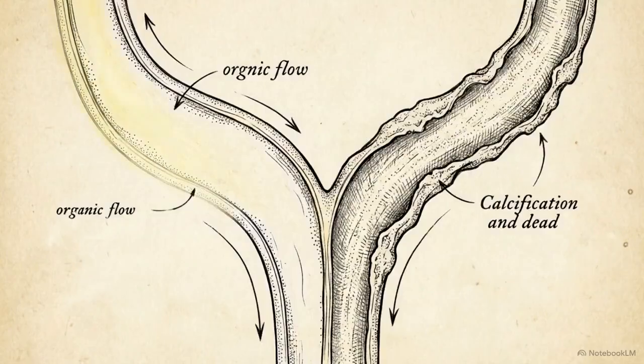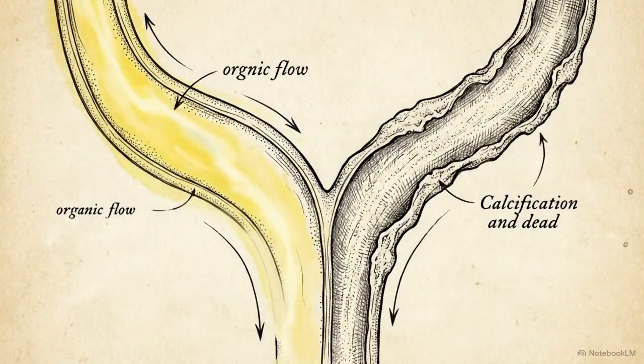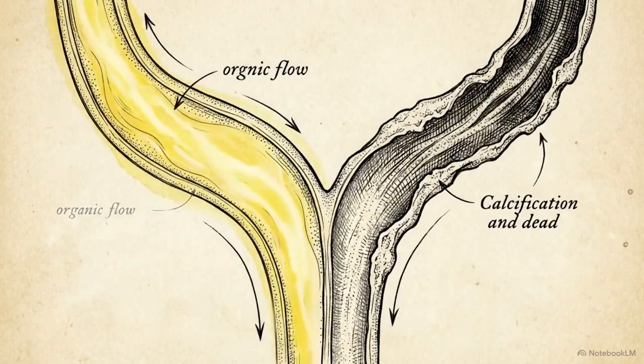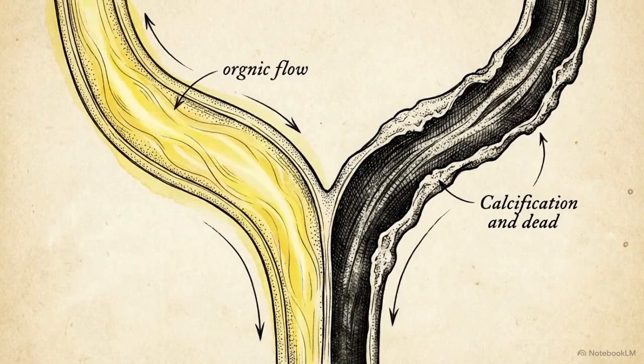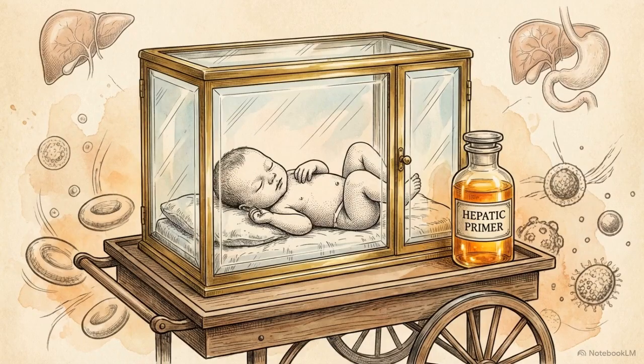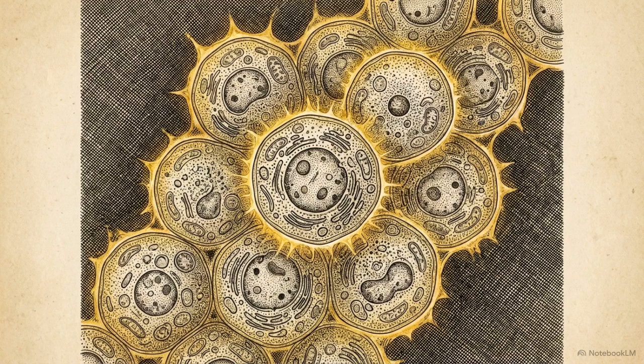We apply similar principles in pediatric cases, specifically when trying to differentiate between neonatal hepatitis and biliary atresia, two conditions with drastically different surgical pathways. Because the neonatal liver might simply be too sluggish to excrete tracer, clinicians pre-medicate the infant with phenobarbital for 5 days. This upregulates the cytochrome system, ensuring the liver is completely primed to move the tracer if the physical ducts are open.